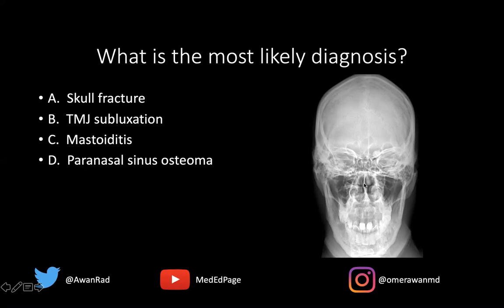This is the nasal septum, and these are the paranasal sinuses. There's no inferior orbital rim fracture here — no fractures here. Taking a look at the TMJ joints, the mandibular condyles are well seated along the temporal bones bilaterally, so there's no TMJ joint subluxation.